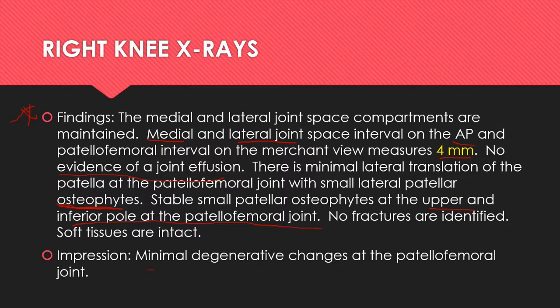There are minimal degenerative changes at the patellofemoral joint. So we would expect perhaps minimal degenerative changes at the patellofemoral joint in a chronic distance runner. These findings are not significantly out of normal range for what we would expect for a 55-year-old female.